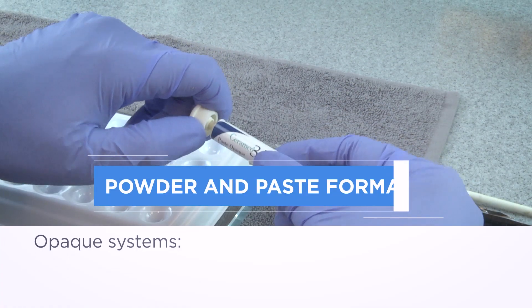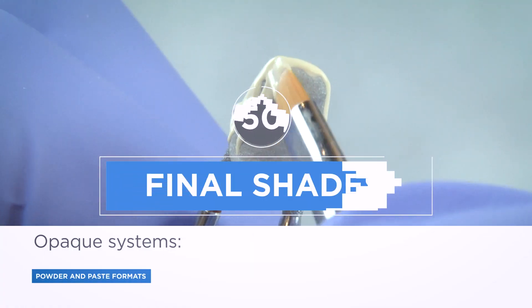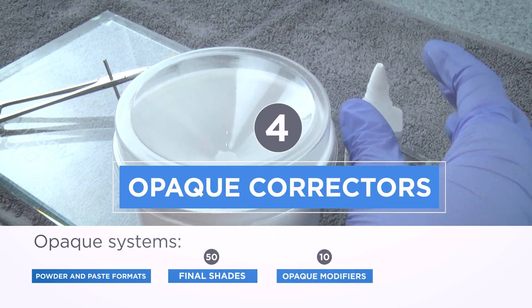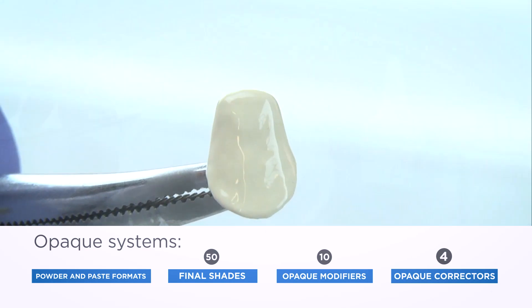Opaque systems, both powder and paste formats, are available with paste being widely applied. Our innovative light scattering crystals are designed to add vitality and mimic natural dentition.